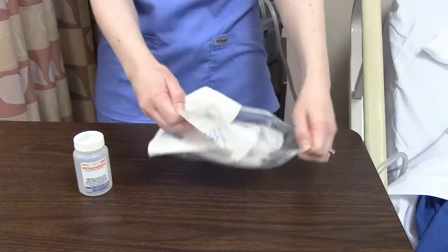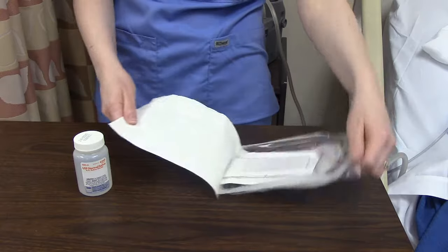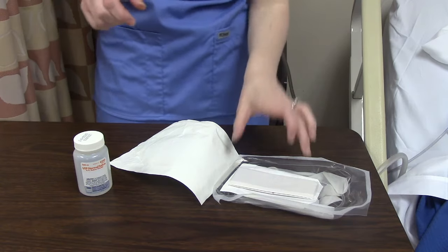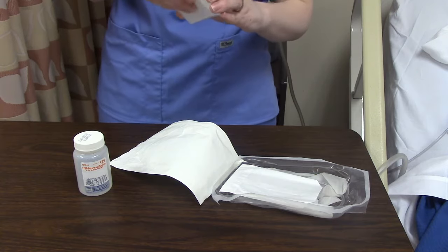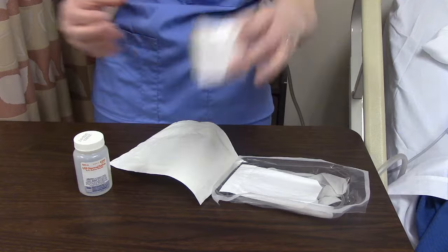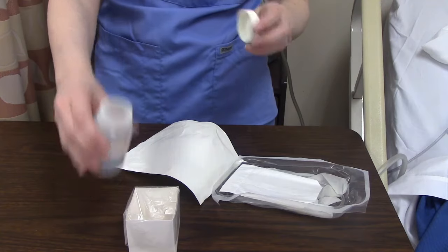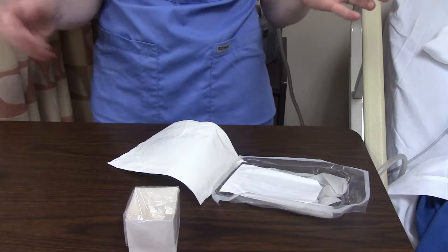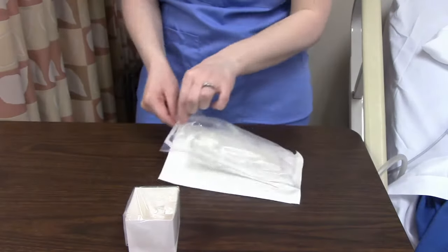We always open away from us because we do have to be sterile with this. First, let's grab our little box, because the little box doesn't have to be sterile. I'm only touching the outside of the box. Then I'm going to put my normal saline in the box.